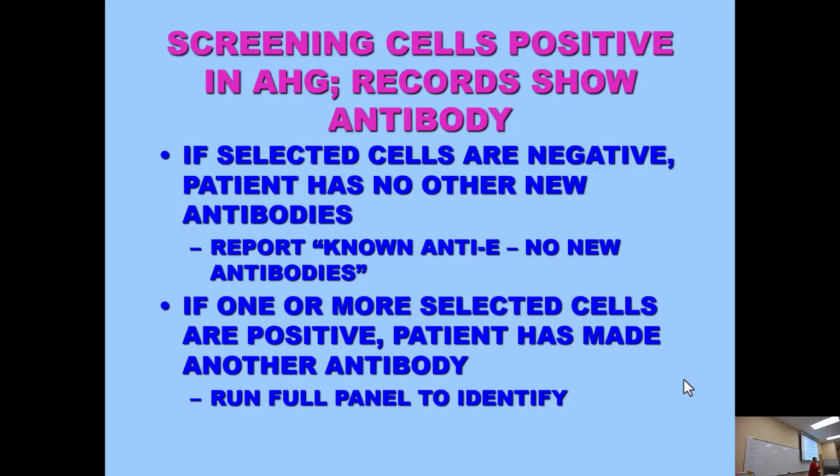If one or more of the new ones are positive, now something else is causing the problem. So because something else is the cause, now we can run a whole panel and try to identify what else is causing the problem.